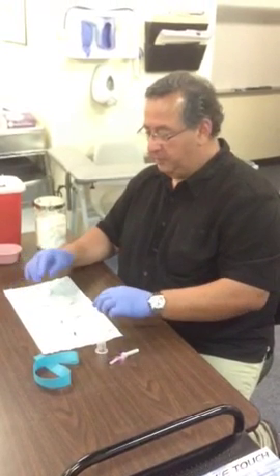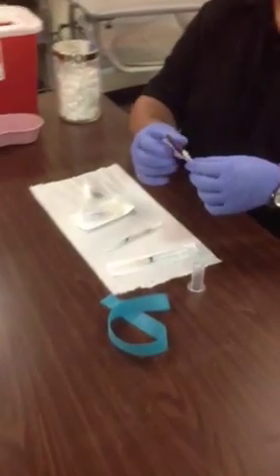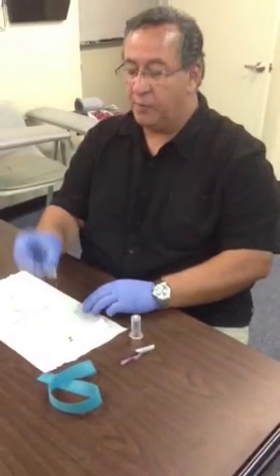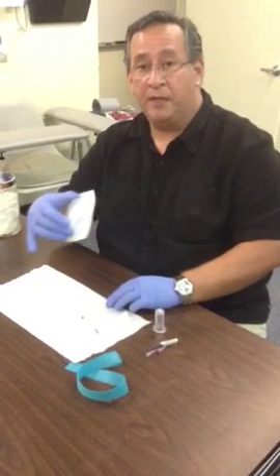There are many different types of needles that you're going to probably be using: the vacutainer needle, a hypodermic syringe and needle, and the butterfly needle.